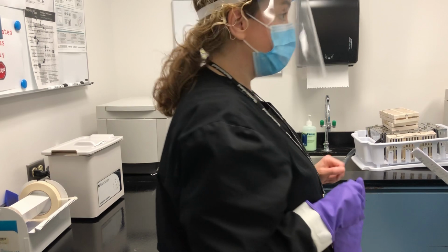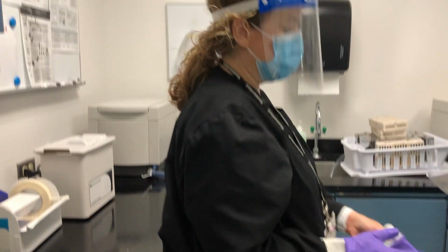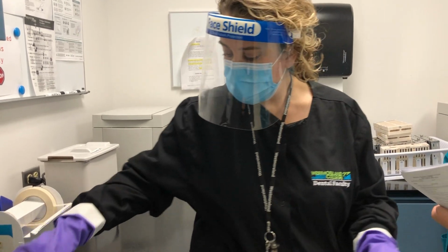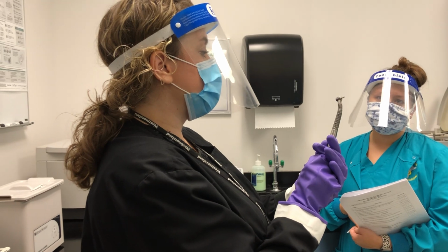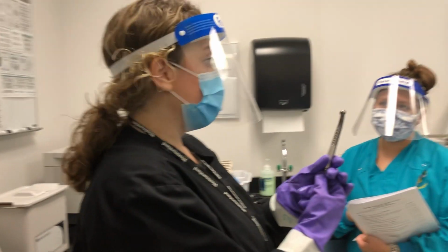Okay, so the next thing on there would say to clean and lubricate your handpiece correctly. This we're going to just have you vocalize for us, verbalize. But this is what the handpiece looks like. So do you think we can just clean and lubricate with the burr in it? No. Or do you think we should take the burr out and put it where it belongs?